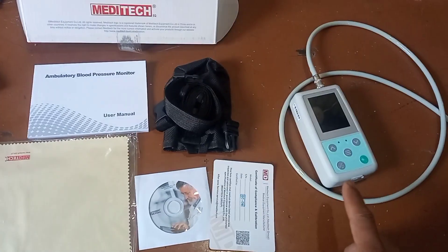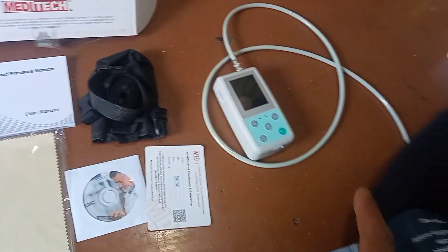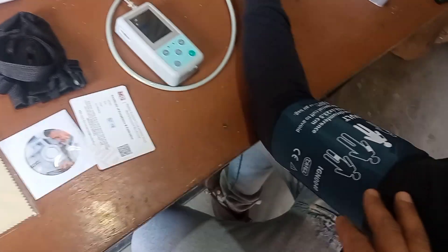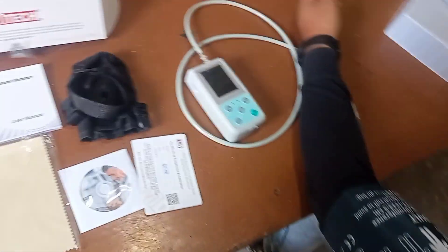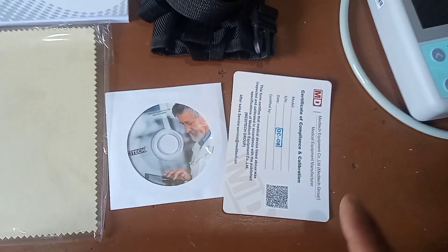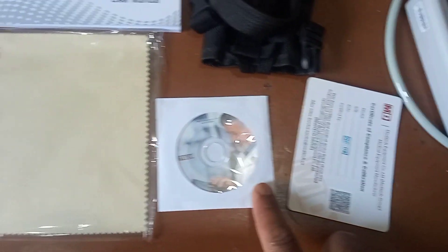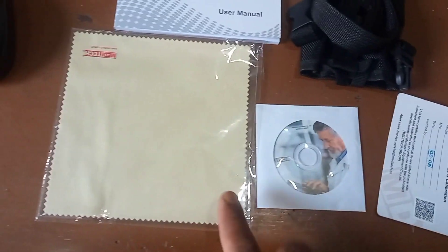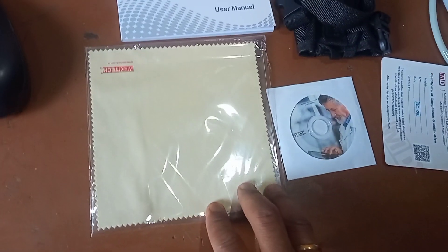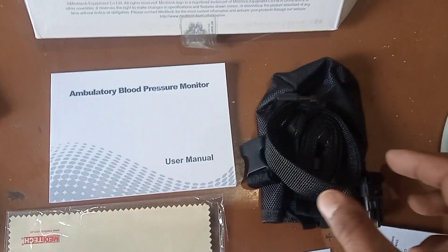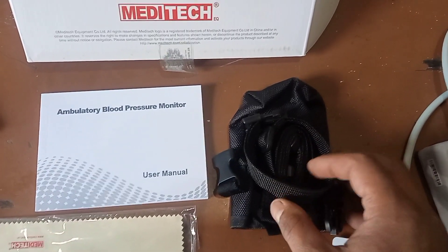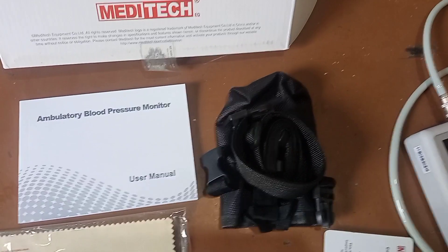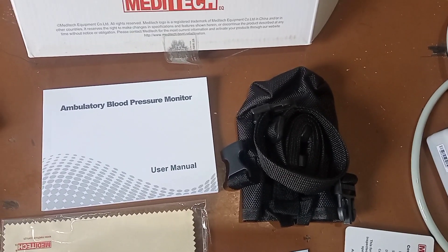Okay, this is the system and this is OSPY. OSPY is connected with the cuff on the patient. This is the warranty, decal, software, cleaner, handkerchief, user manual, and this is the carrying bag which we will send the patient with the machine.